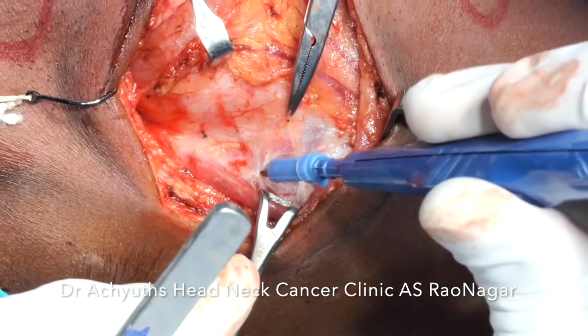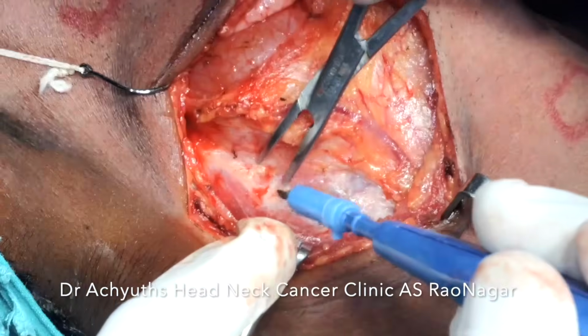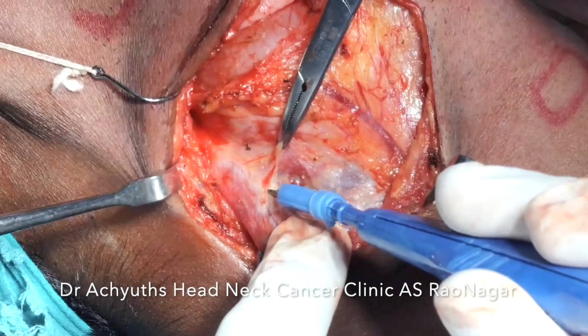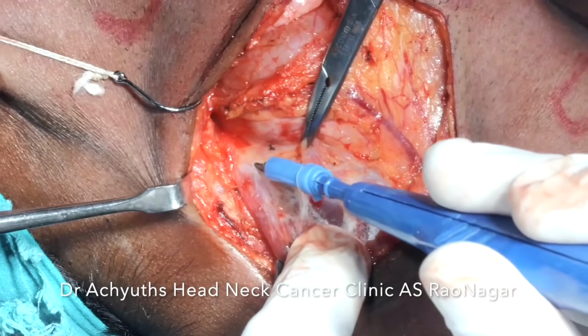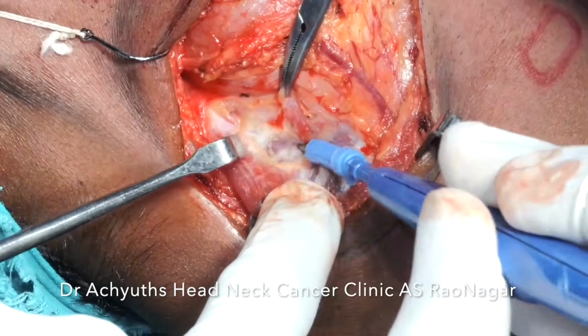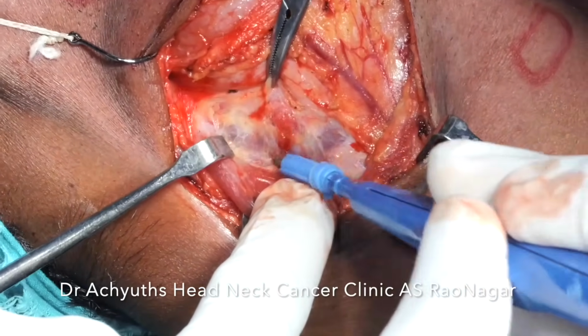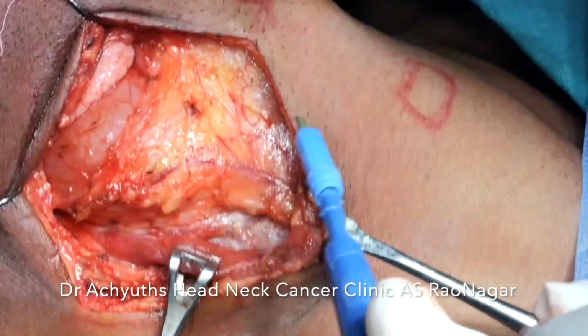Avoiding tenting of the sternocleidomastoid muscle, we are gradually advancing the attachments of the muscle with the Babcock and trying to figure out where the inferior border of this lateral border is.